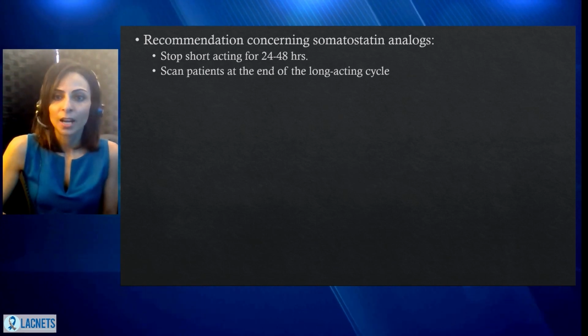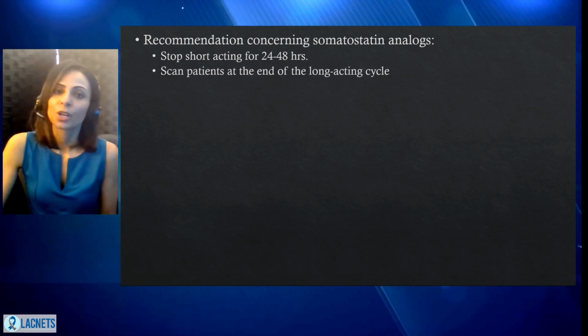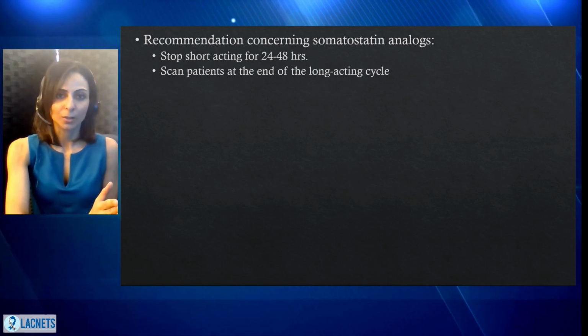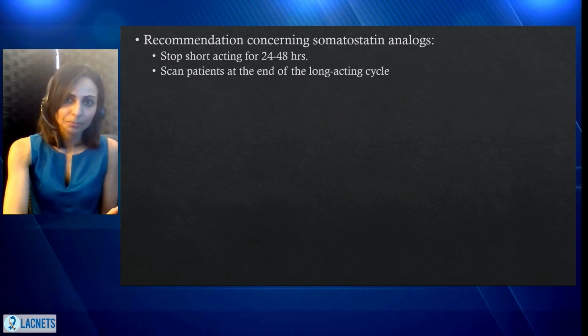So the recommendation, the guidelines, is to stop short-acting somatostatin analogs for 24 to 48 hours before the scan, and to scan the patients at the end of the long-acting cycle, like of the long-acting somatostatin analogs. So what does science say about that?